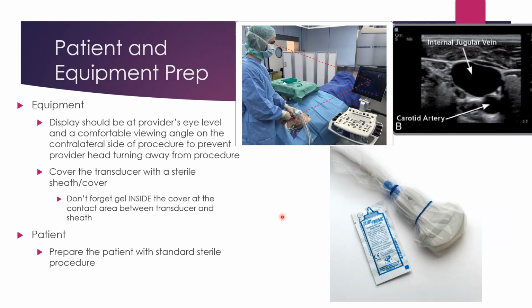So once you go to prep, obviously you're going to be prepping your patient and prepping your sterile field to get ready for this exam. Make sure that you're setting up the equipment in a comfortable position so that you're not looking at the patient's neck and then having to turn your head to look at the monitor.